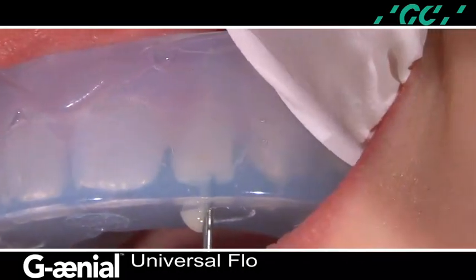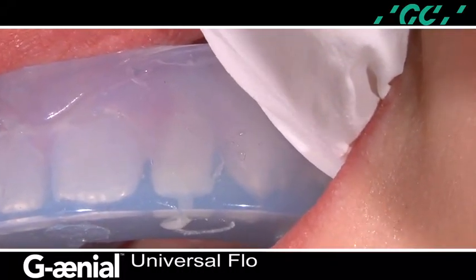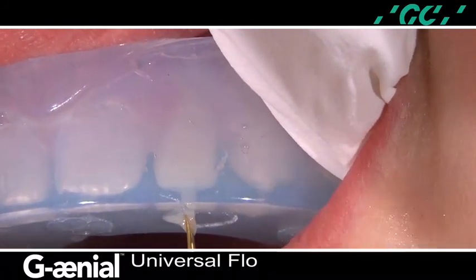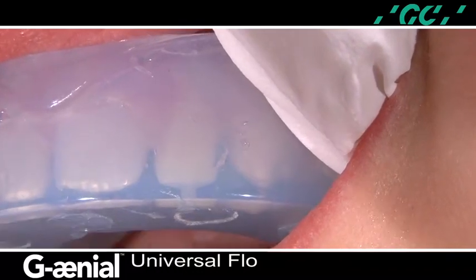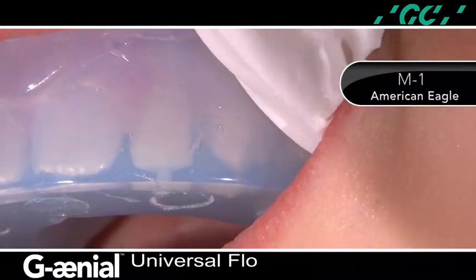Also, by maintaining a constant finger pressure on the buccal and lingual ends of the matrix, an optimal adaptation of the material to the tooth surface can be accomplished. The excess is expressed with this pressure and the residual material is removed using an M1 ball-tipped instrument by American Eagle.